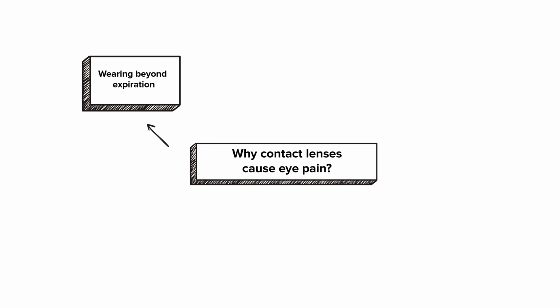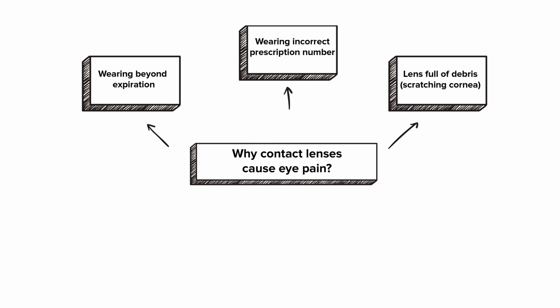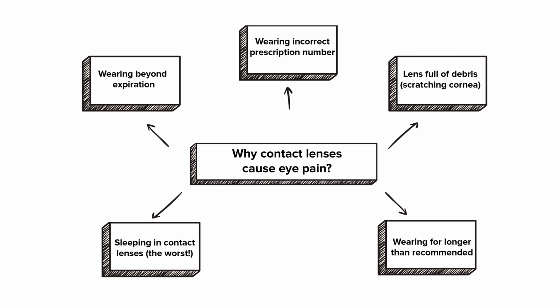The reasons are, one, if you're wearing a contact lens beyond its expiration. Two, if you're not wearing the correct number. Three, if you're wearing a contact lens which is full of debris and it's scratching your cornea. Four, you're wearing it for longer than you should. Or if you sleep in a contact lens, that's the worst.